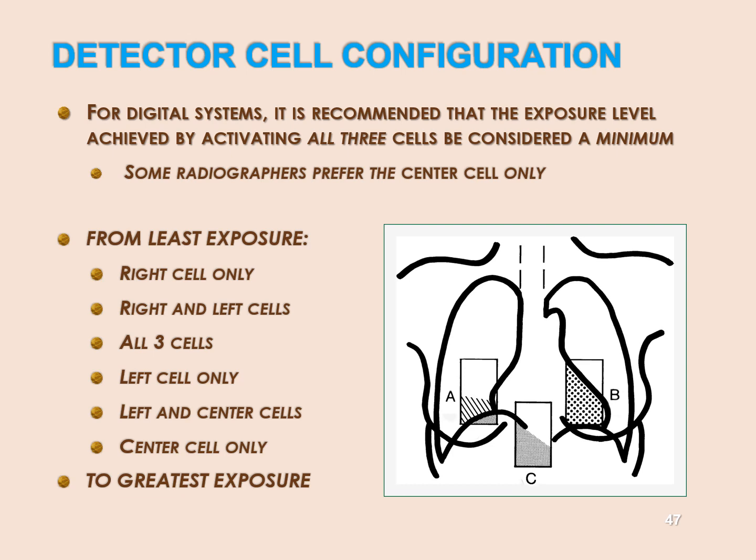And then the centering is not right. The middle of chamber C is the middle of the exposure field, at the diaphragm, T9, T10. I thought we were supposed to center at T7, which would be 4 inches north of there, halfway between where the diaphragm is and where the aortic arch is. So you can see the chambers are purposely mispositioned and purposely too large.